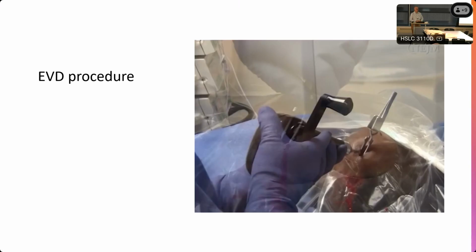But the hand drills, you keep back once you're through, it's also twisted so you don't plunge. So you're saying that the hand drill, we have it back. You feel it getting hard, like slow compression.